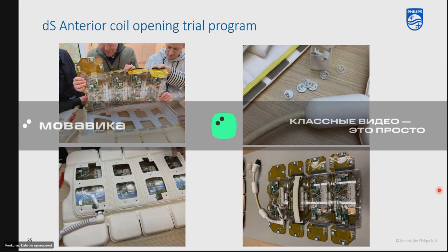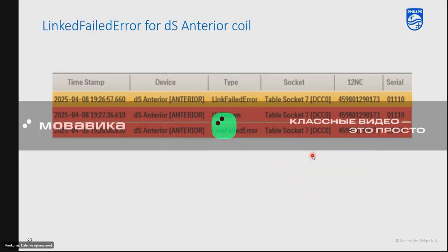Thank you, Kenneth. Just to let you guys know, if this does end up being approved and going forward, we will have a tremendous amount of support for you, including videos like that, as well as a full document dedicated to opening and working on the insides of this coil and the issues. I understand that this looks like a big dump on you guys as far as responsibility. To let you know, though, in parallel to this, there are improvements going on with this coil.